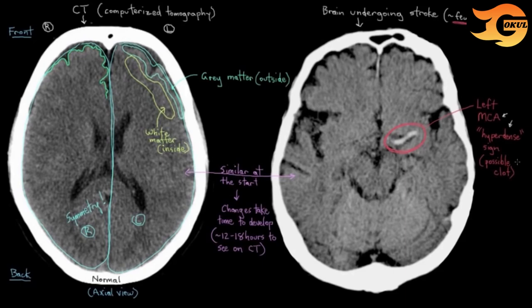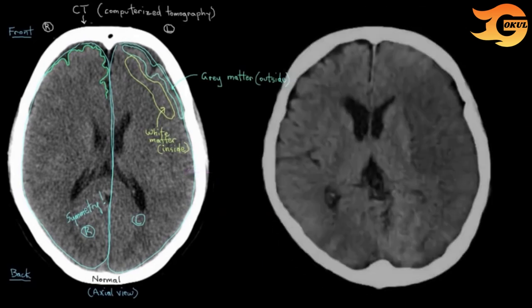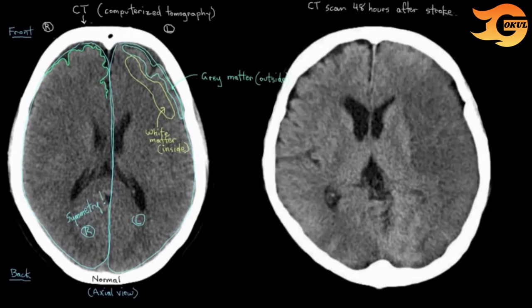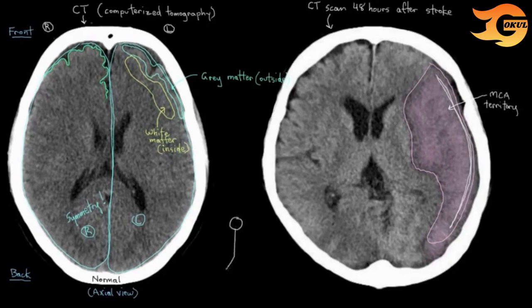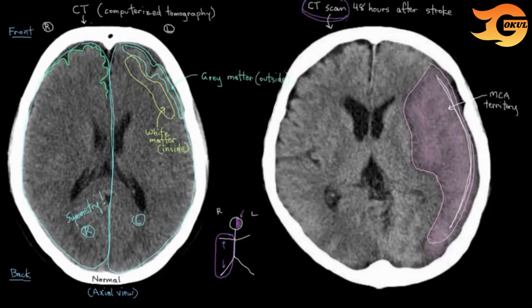In some cases that may be one of the things you can see early on a CT. Here's another CT scan from 48 hours after a stroke. You can see some swelling developing — neurons have been swelling up and dying off, and inflammation in this brain region results in all this swelling. Notice where it is: it's on the outside, sort of the side of the brain on the left, which is primarily supplied by the middle cerebral artery. By this point you'd have already done a physical exam and probably discovered problems on the right side of the body, suspecting a problem on the left side of the brain, and this CT scan adds evidence to that diagnosis.